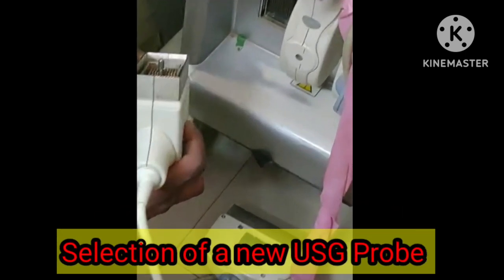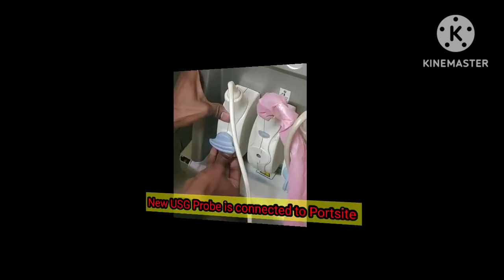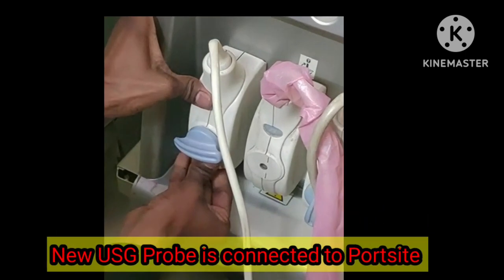Now selection of a new ultrasound probe which is to be fitted to that port site. This slide showing new ultrasound probe is connected to that port site.